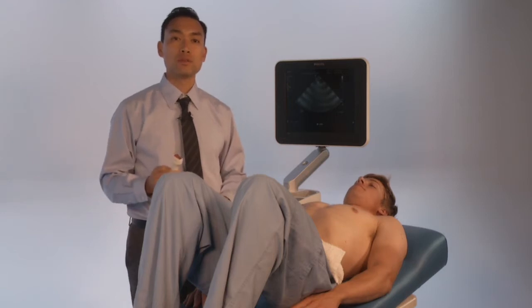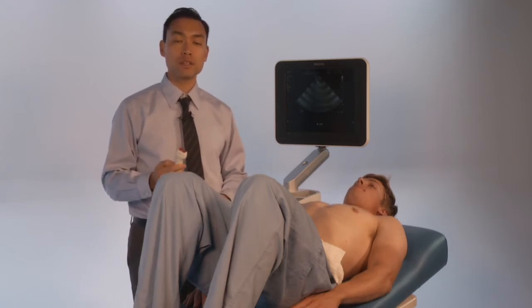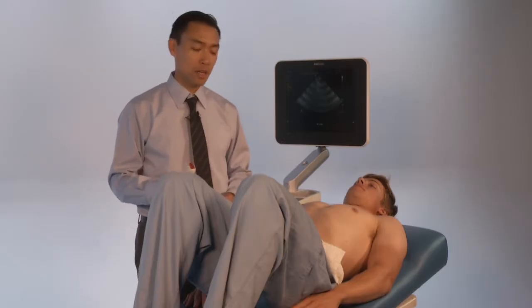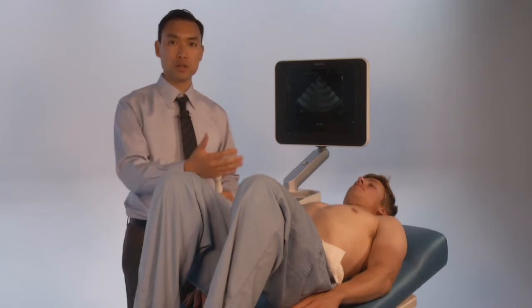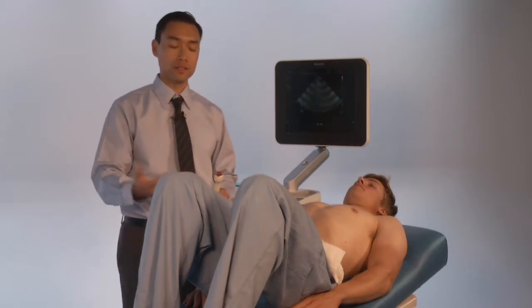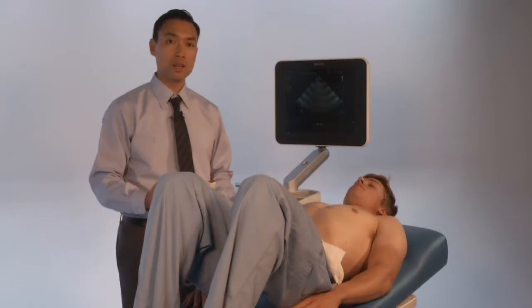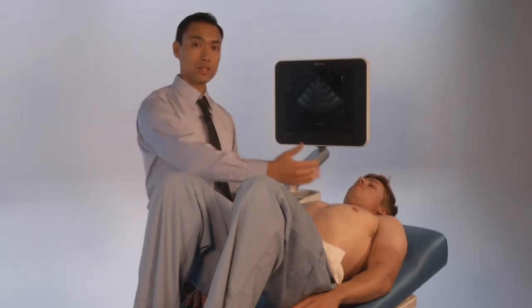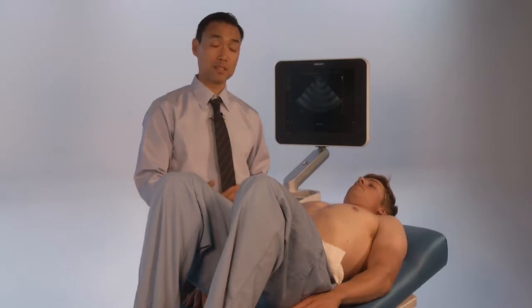We're going to go over how to do a genitourinary assessment with ultrasound for a male patient. The genitourinary system consists of the kidneys, the ureters, the bladder, as well as the prostate and the genital system. What we can assess with ultrasound are the bilateral kidneys, the bladder, and the prostate.